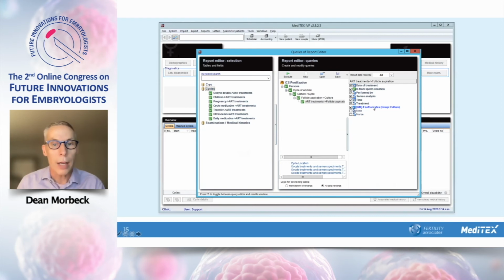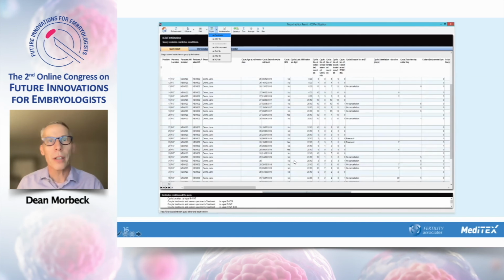We were looking for a while at whether there were soft oocytes, or what we might call those eggs that are brittle, which is kind of the opposite, two things for the same, where the membrane breaks on impact. So we were tracking that for a while. So you can see that there's quite a bit you can do there. And when we run that, we get this report here.